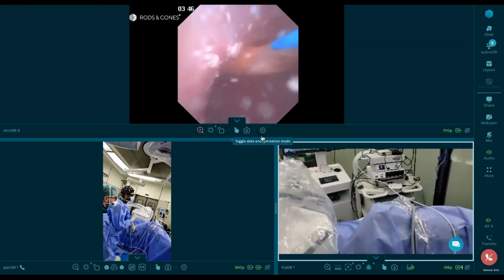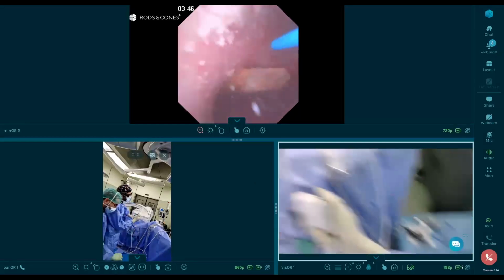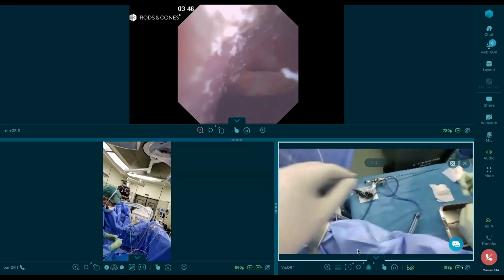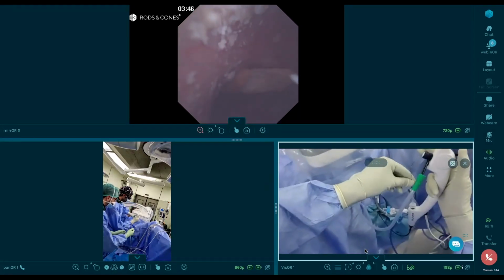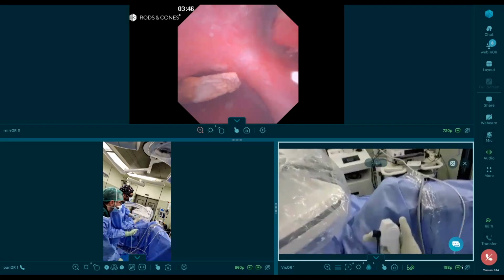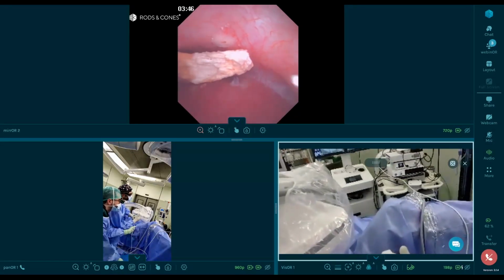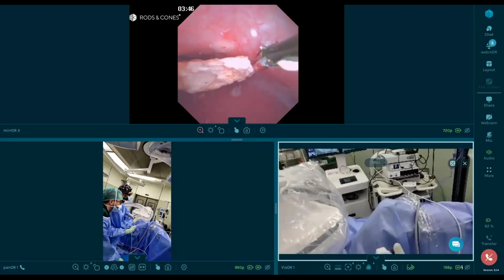I think I'm having trouble because this is an inferior anterior calyx. Dame la cesta. I'm going to relocate this stone, which was the first idea. I'm going to keep the first idea, relocation of the stone, as shown in randomized control trials, which increases stone-free rates. So that's a good idea.